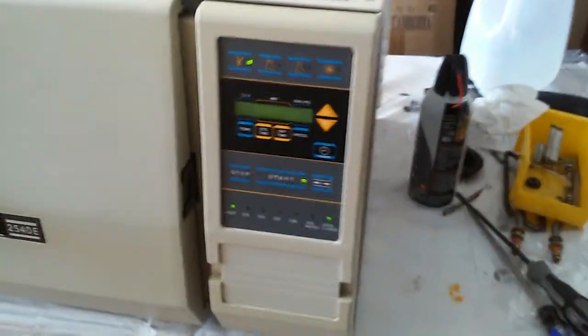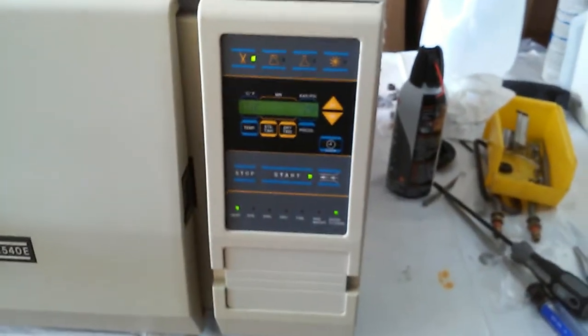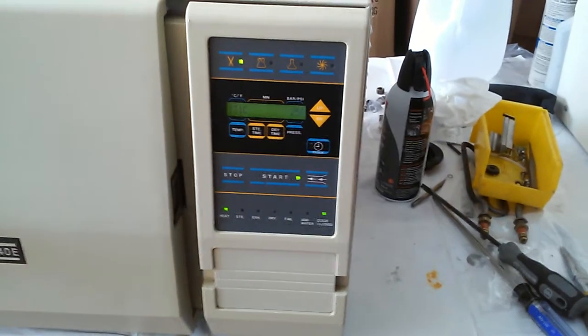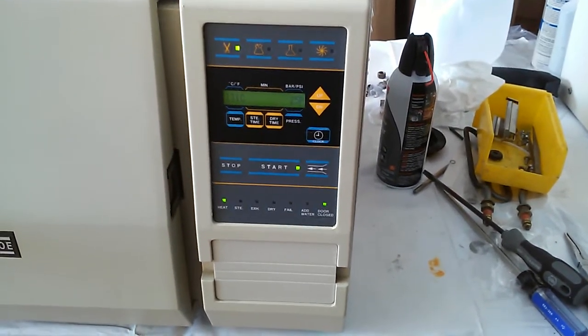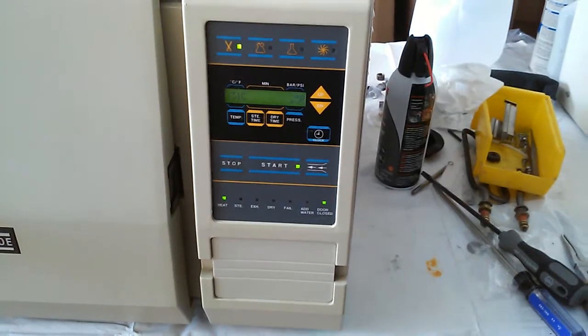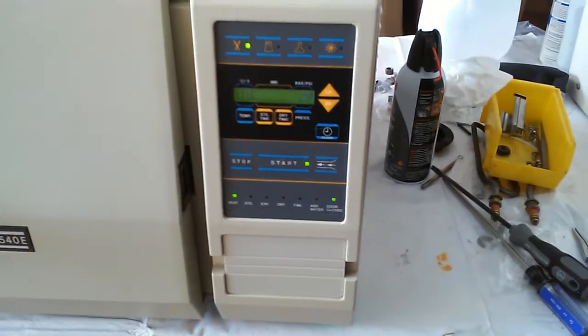On this automatic machine, the control panel on the right side is everything digital. You just push the button — it's very simple. Normally, after you first set up, you just push that button and it will start to work for you.